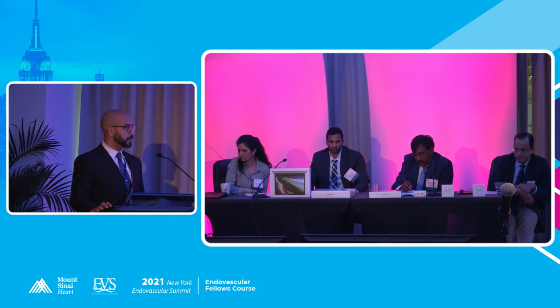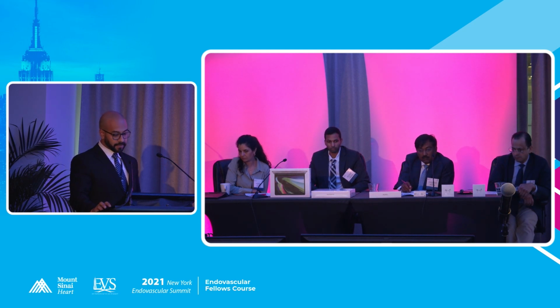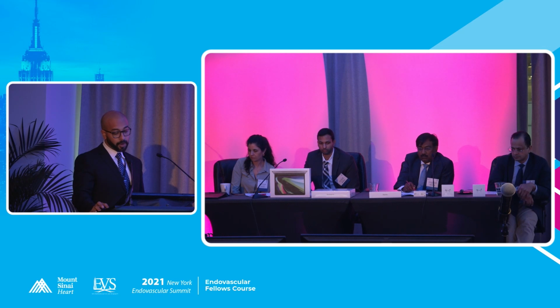empirically, the left subclavian artery should be covered, and if the patient has symptoms afterwards, we'll deal with that. We'll do the left carotid subclavian bypass, and then figure out what we need to figure out from there. But looking at this CAT scan, I don't believe that that would have made a difference. And the reason I say that is looking at that aortic arch right where that entry tear is, and even proximal to that, it's full of thrombus.